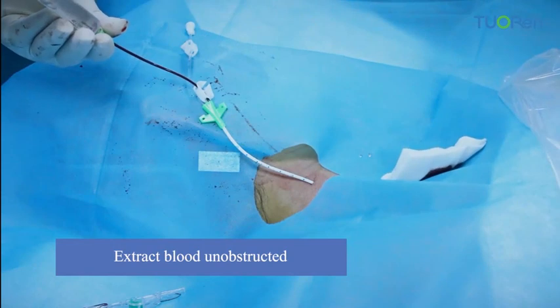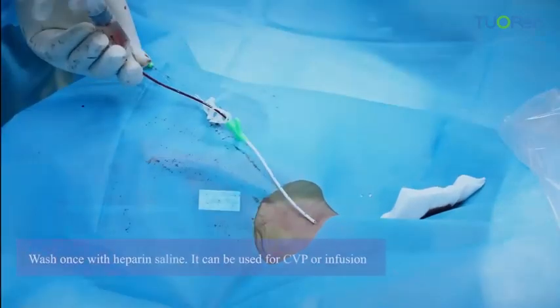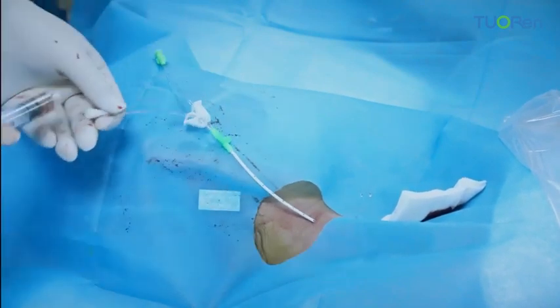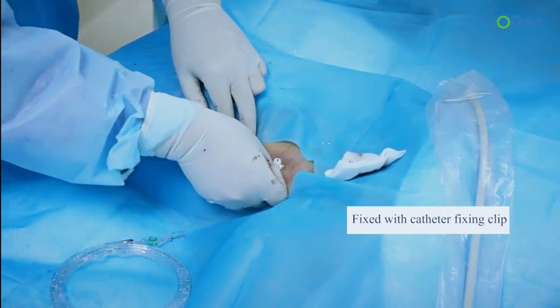Extract blood unobstructed. Install the heparin cap. Wash once with heparin saline. It can be used for CVP or infusion. Fixed with catheter fixing clip.